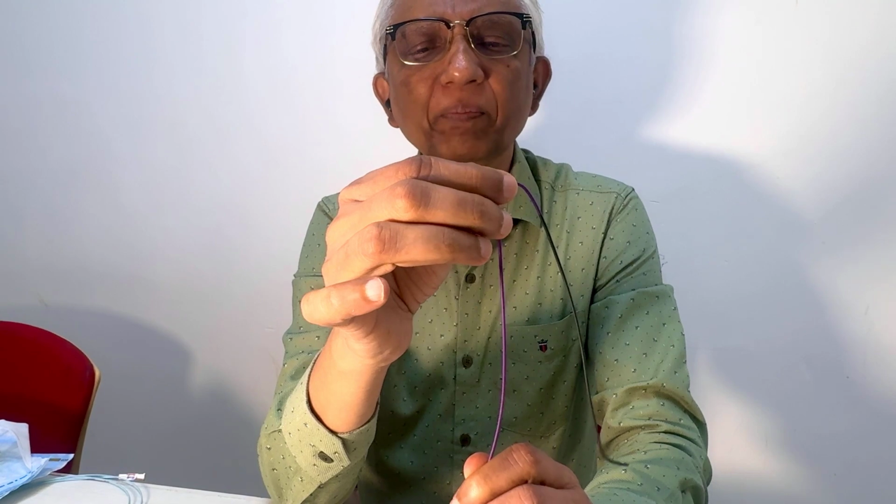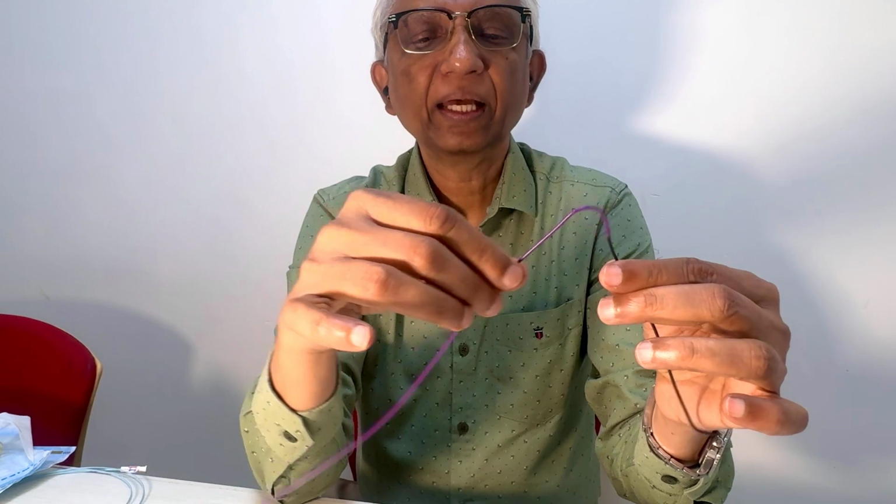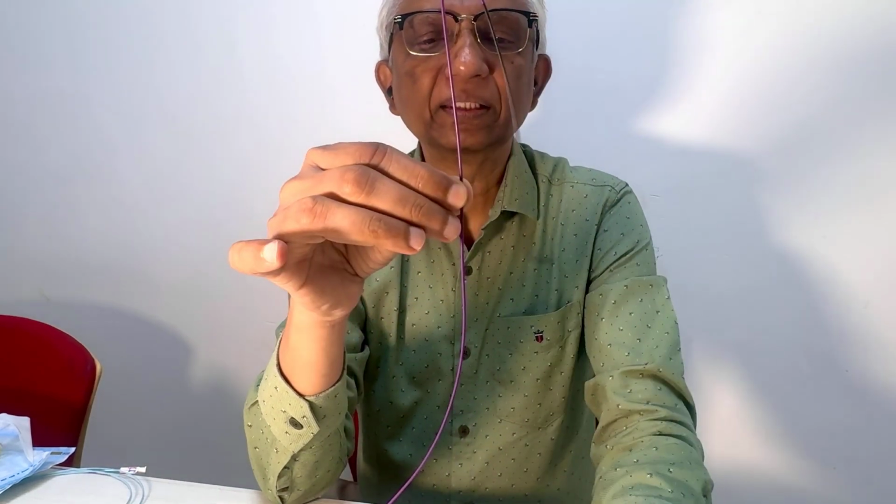Once you come to the opposite side, at this point, there's actually a radiopaque marker, and you will see it. And at this point, you just push this catheter up and it forms the curve. So technically, it will look like this in the bifurcation. As you push it up, the whole loop goes up and you have created this curve.